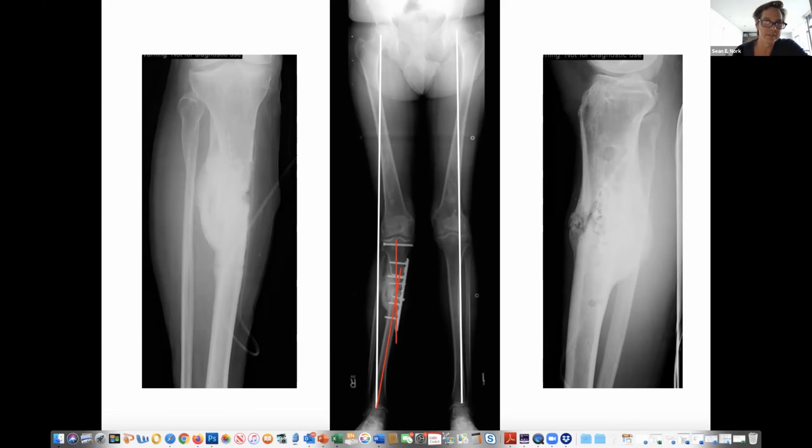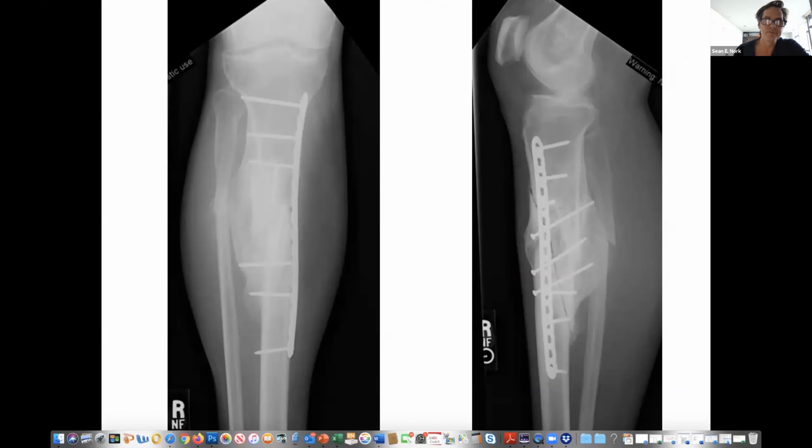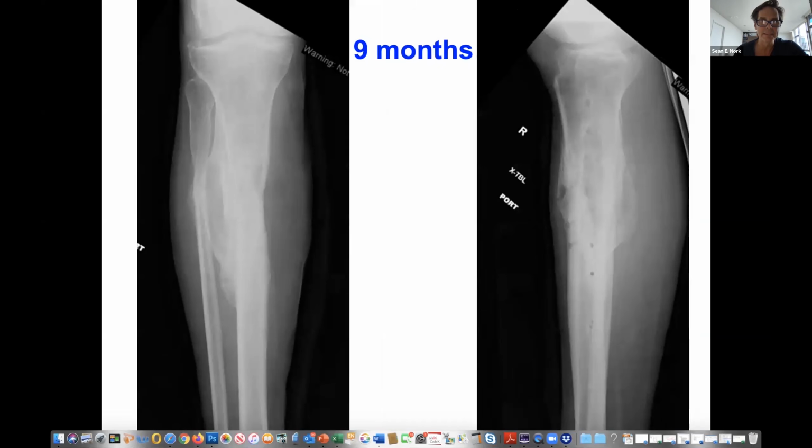But you can also see the problem as you think about ways to fix this valgus malunion of the tibia. I certainly was not very interested in doing a transverse, a closing, or an opening wedge osteotomy through that mass of healed callus that's about the size of a grapefruit. So I chose to do a long oblique osteotomy that avoided that large amount of bone posterolaterally. And I think you can see that plane of the osteotomy. And that allows me to correct the coronal plane deformity that you can see. And it's an incredibly stable osteotomy that just hinges and rotates about the center of that obliquity. And this goes on to heal very predictably, and that's after plate removal.